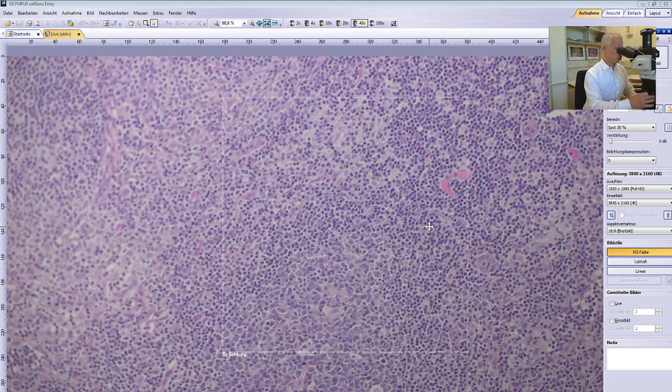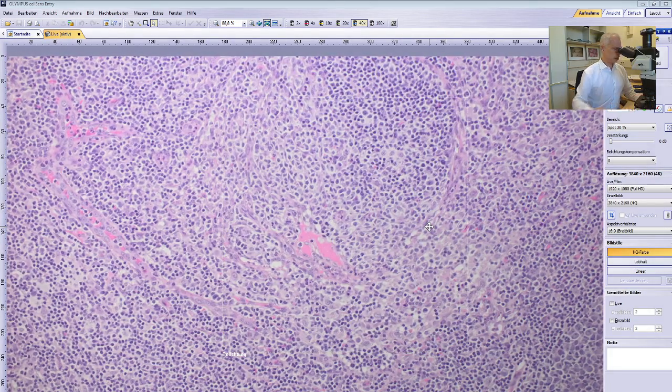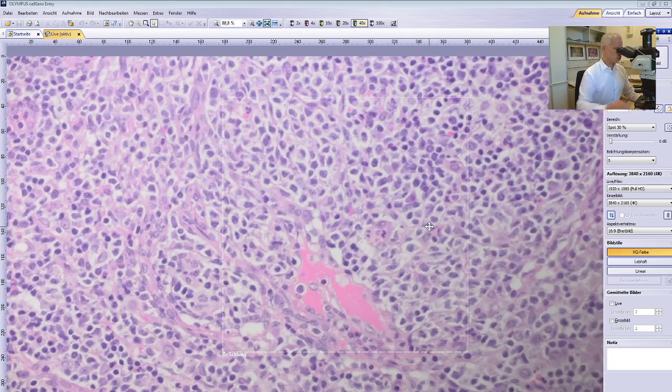Here's an area that was appearing a little bit paler. It's hard to see. So what this exactly is, if you look very close, I'm going to go to a high magnification. You see these are medium-sized cells, looking a little bit centrocytoid-like. You see, at least up here, a little bit of granulocytes in there. Here's another granulocyte. That's a peculiar mixture you usually see in monocytoid B cells.